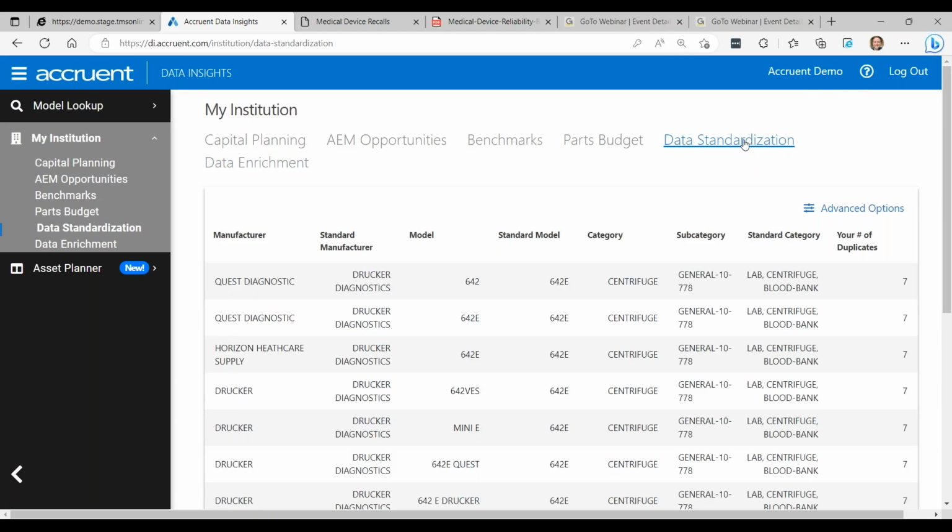Right now, you'd have to go into your CMMS and use their mass tools. All CMMSs should have mass edit capabilities to do that. One of the enhancements we're looking at, to make you want to come to TMS, is to put an option there to say, hey, I like this, make it in TMS, and then have it do the update.